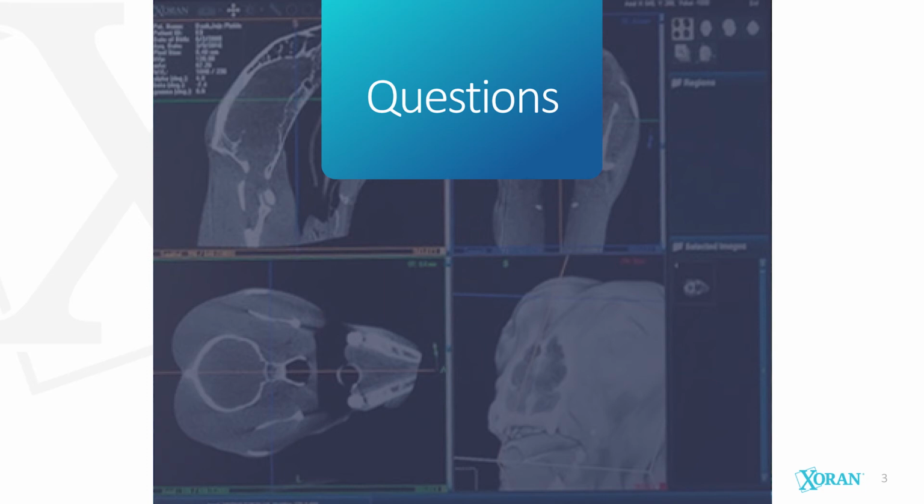Okay, so we dealt with that right away, and I believe that it is provincial. So you check with your own province and your own association as to what their regulations are going to be. So as soon as we got it in, we had it inspected, and the inspector will tell you what they require.